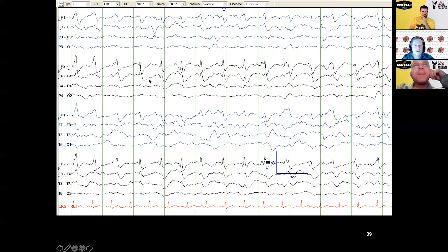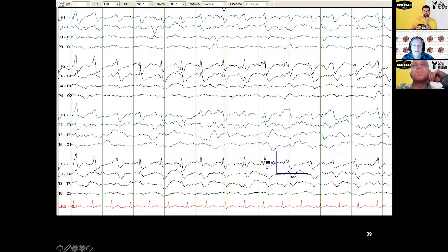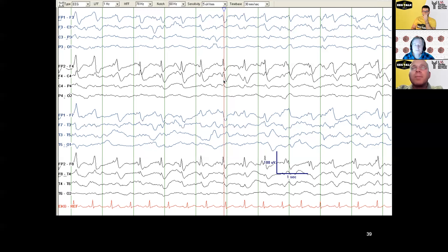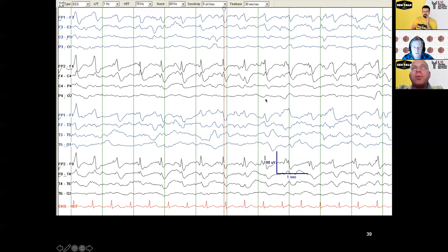This LPD — is it LPDs+R? It's hard. There's rhythmic delta or spiking and there's also periodic discharges, so is it spike-wave? The problem is the spike here is in a different place — sometimes in a trough, sometimes near the top. There are not six in a row that clearly show spike-then-wave; here it's just a sharp wave, so it's not quite regular enough to call it spike-and-wave. We call this LPDs+R.